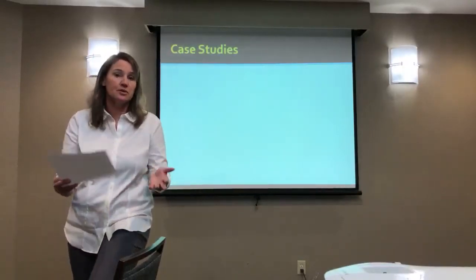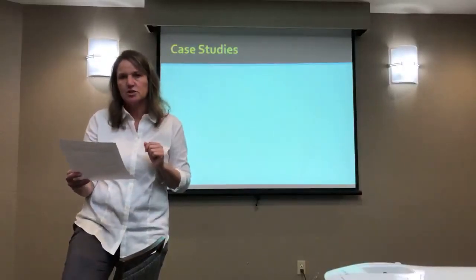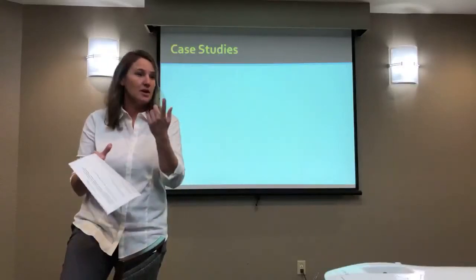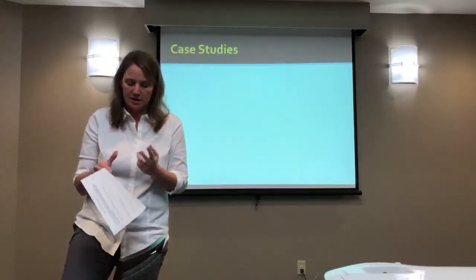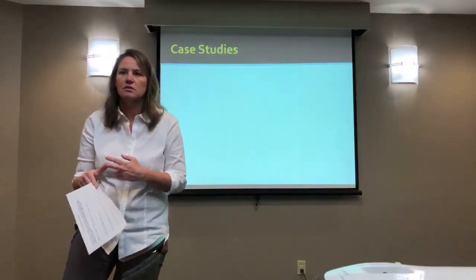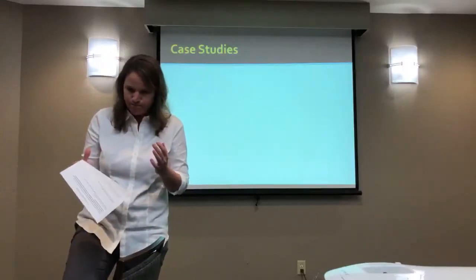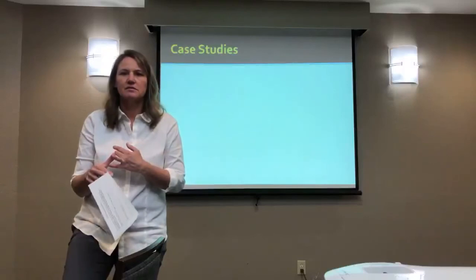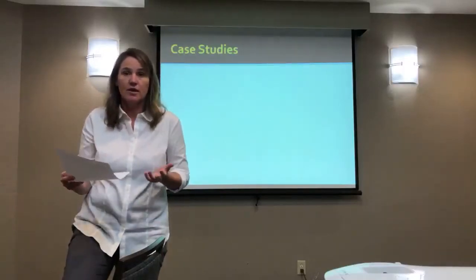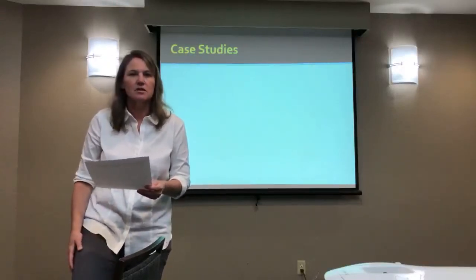So if I was gonna proceed with it for healing, based on this location, what frequency would you use? 3 megahertz. This is a superficial area. What about duty cycle? Would you use a duty cycle? Yeah, pulsed, so 20% duty cycle? Intensity: 0.5 watts per centimeter squared. I can't argue with that. I don't have any reason to argue with that. Yes, I would do that. What do you think?